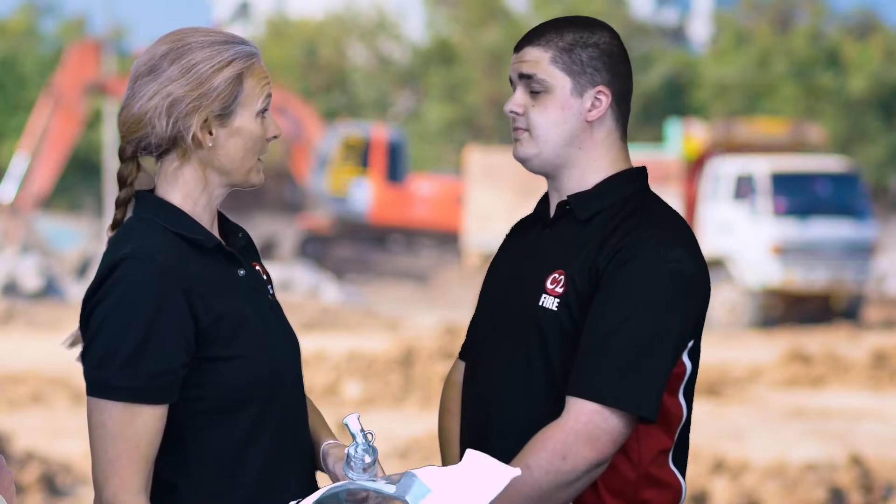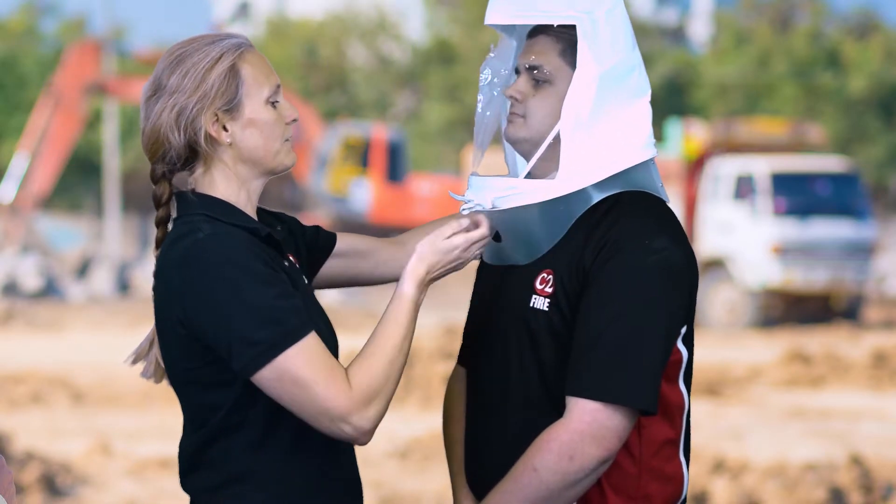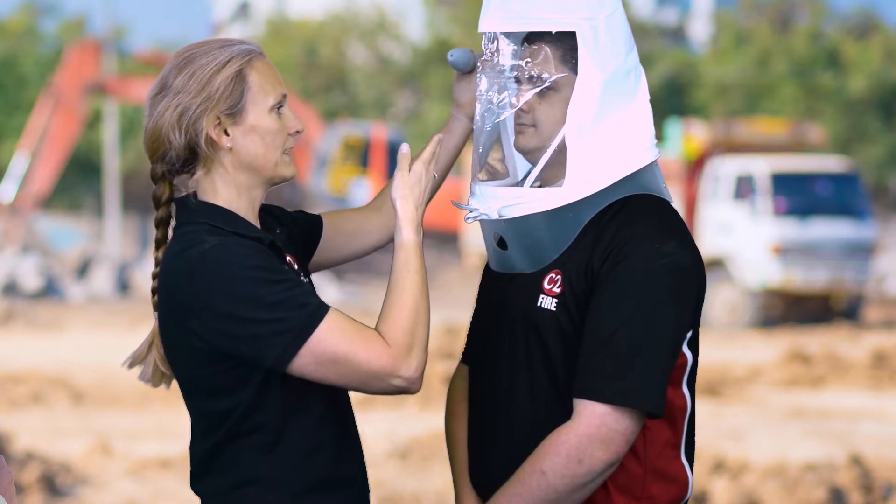So Tom, are you claustrophobic? I'm not claustrophobic. I'm going to place this hood over your head, and I'm just going to gently ease it forward so there's a gap between the front of the hood and your face.